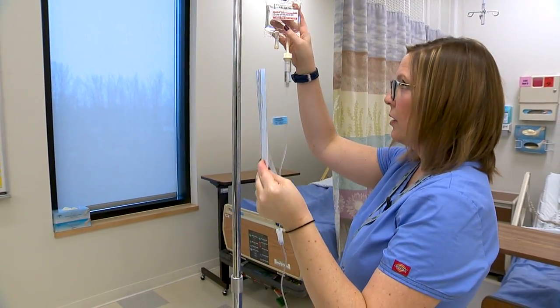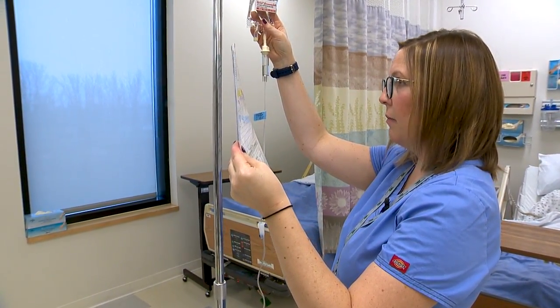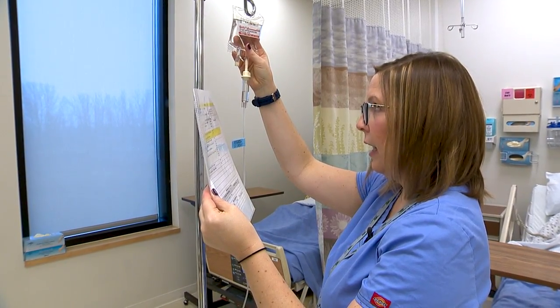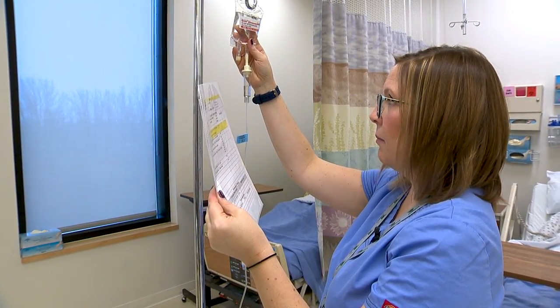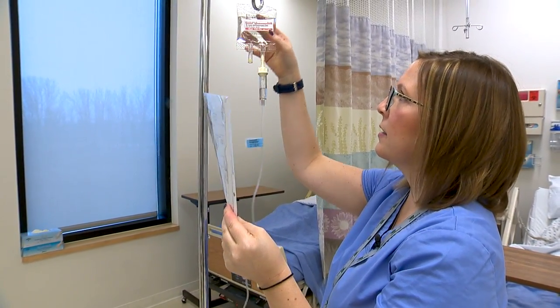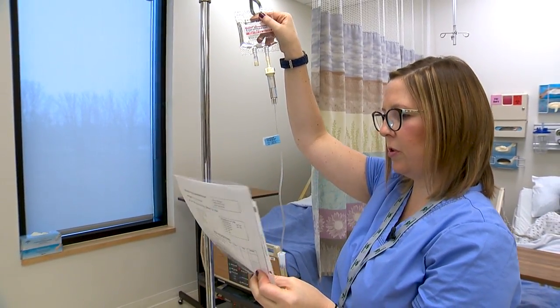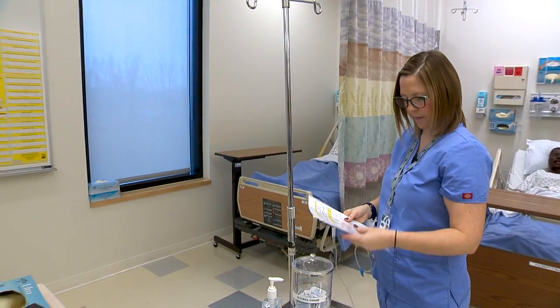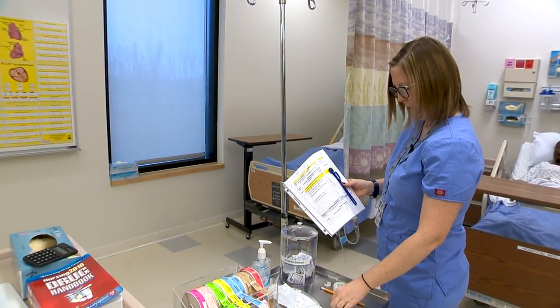Morgan Brown, ciprofloxacin, 50 mLs, 400 milligrams, IV piggyback, due today at 9 a.m. Again, my medication looks good and it's not expired. So now I can get ready to go to the patient's room. I'm going to grab my medication, my MAR, the plastic hook, and an alcohol swab.